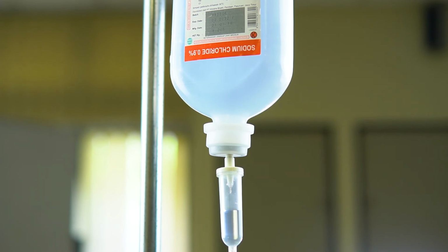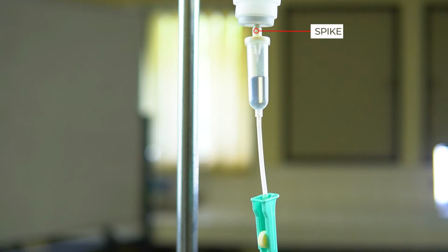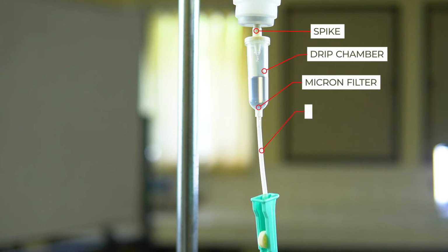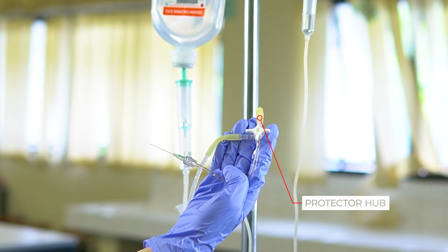Infusion set is most commonly used to administer fluids from an intravenous container by gravity. In general, the basic components of an IV infusion set are a spike, which punctures into a sterile bottle containing an IV solution, a drip chamber, micron filter, long sterile tube, flow controller, and a connector covered with a protector hub.